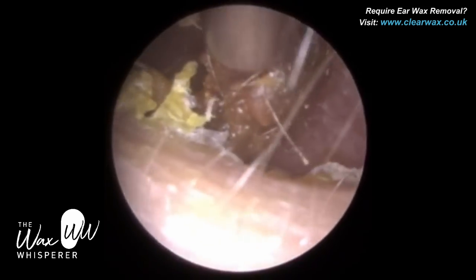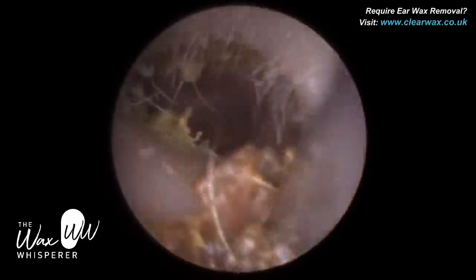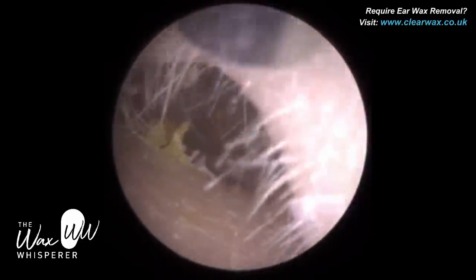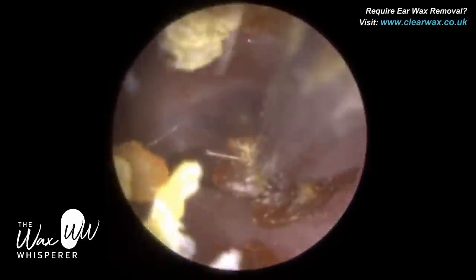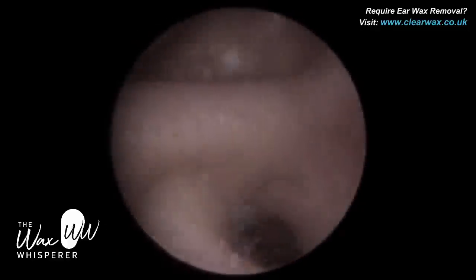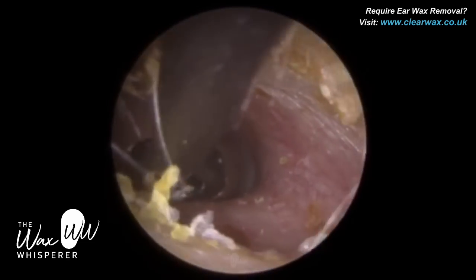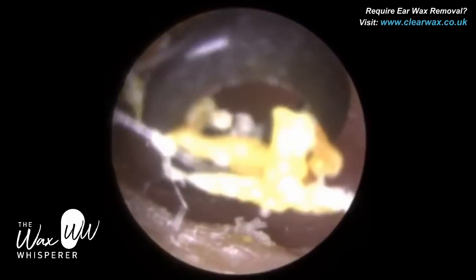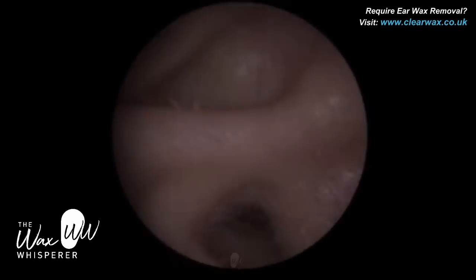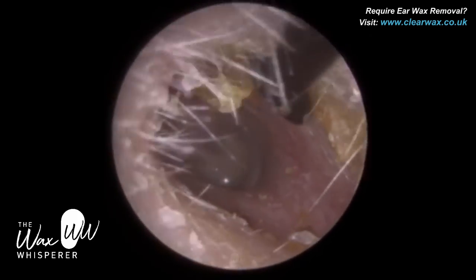There was someone today who made a comment indirectly inferring that the technique they use — portable microscopes that converge your interpupillary distance — is superior, and insinuating that an endoscope doesn't provide depth perception. They later denied it, tried to be funny and make a mockery of it. But we don't want to be giving false, misguided, inaccurate information, not only to fellow professionals but to the public.